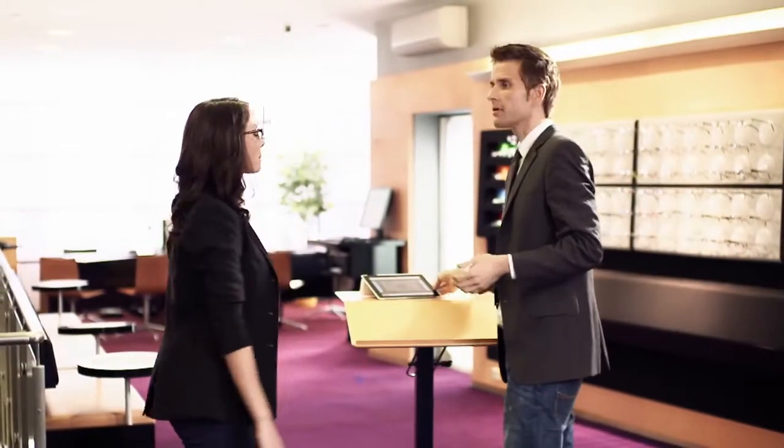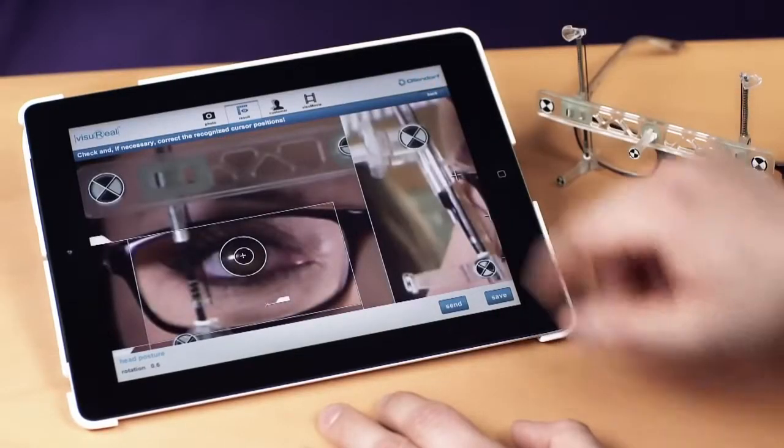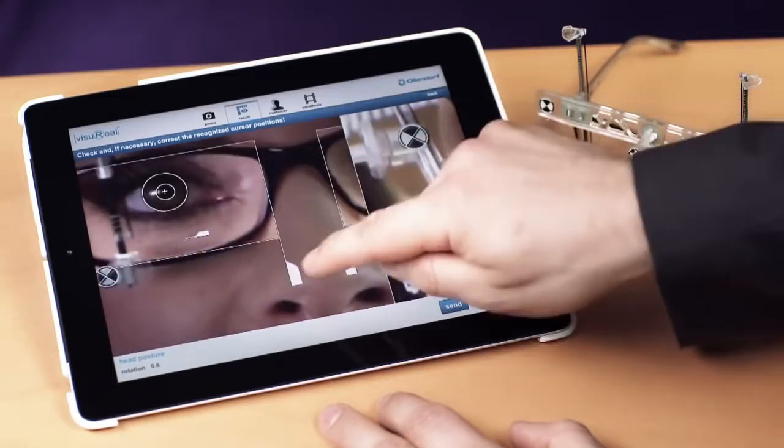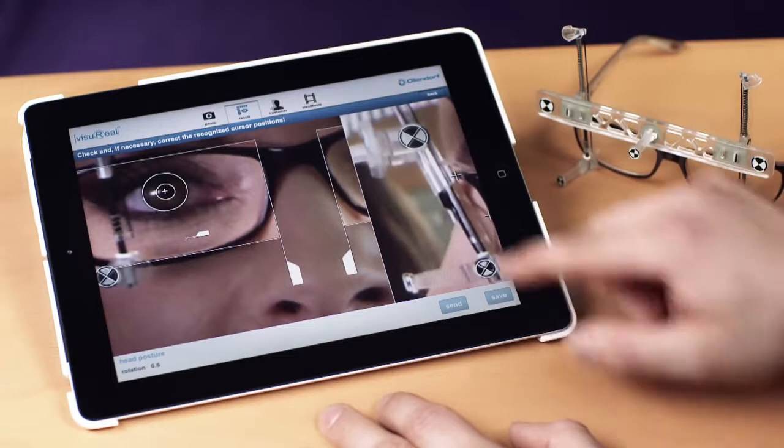When you receive the first measurement results, check if all automatically detected measuring cursors are properly positioned. If not, activate the zoom mode and move the cursors.